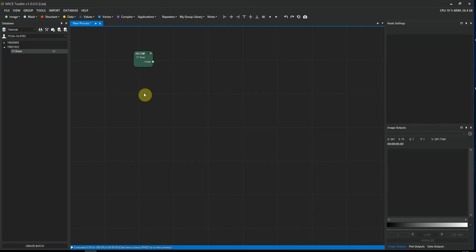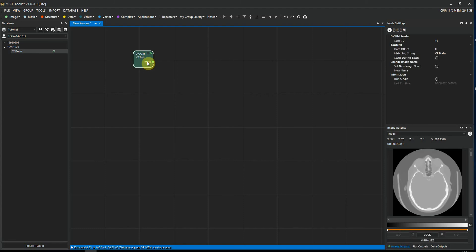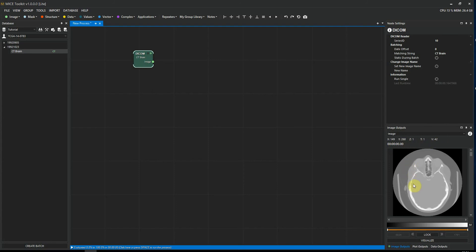When the workflow has executed, we can see a green light in the upper right corner of the node. That means that the node has executed successfully. If we highlight this node, we can see the output in the image output panel in the lower right. As you can see, we have some numbers above the image here. They tell you the X, Y, and Z voxel index and the voxel value where the cursor is.